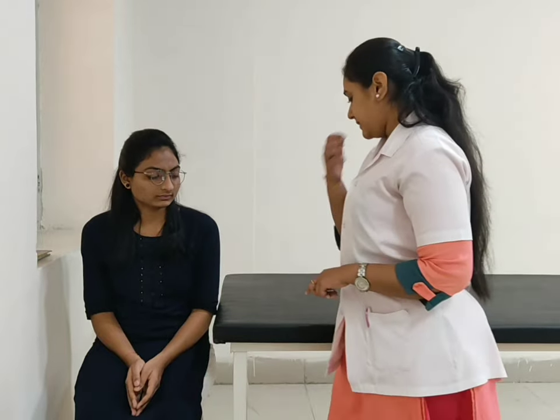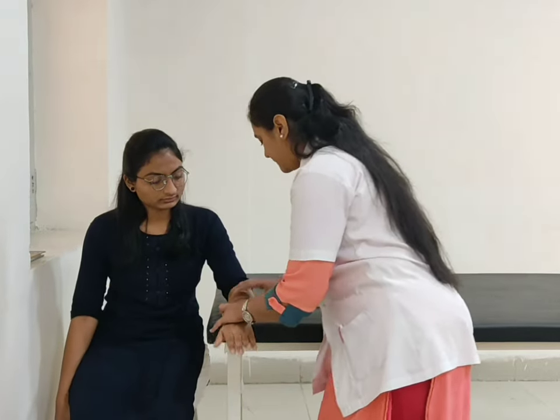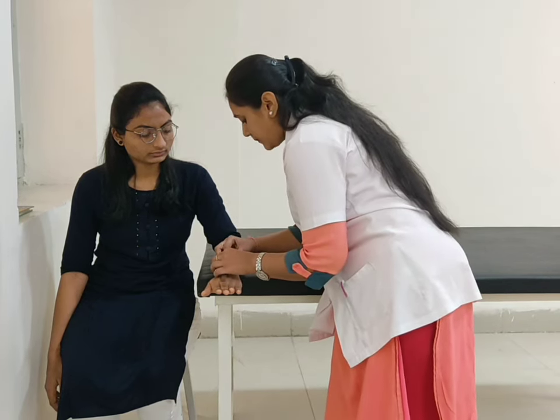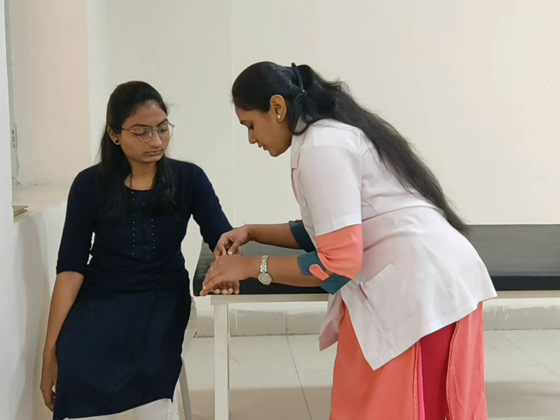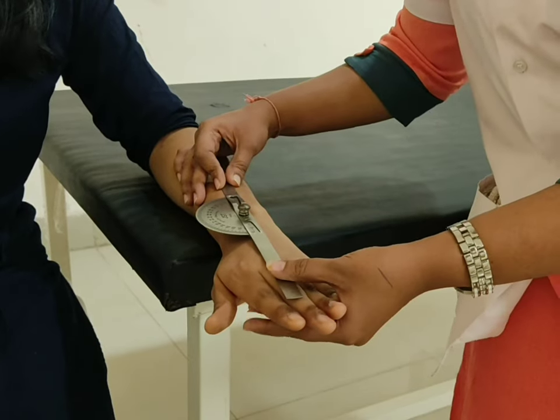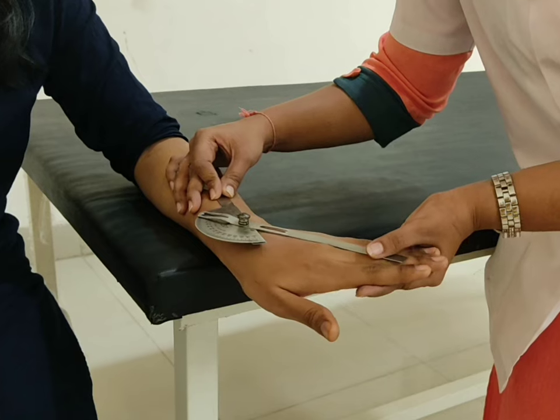For ulnar deviation, patient position sitting on a chair. Forearm supported over the table, pronated. Fulcrum at the middle part of the wrist joint. Stable arm at the midline of the dorsal aspect of the forearm and moveable arm in line with the middle finger. Now ask the patient to move your hand towards the little finger. Normal range of ulnar deviation is approximately 30 to 40 degrees.